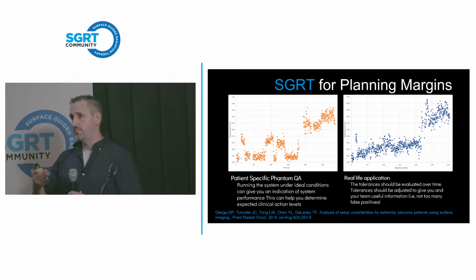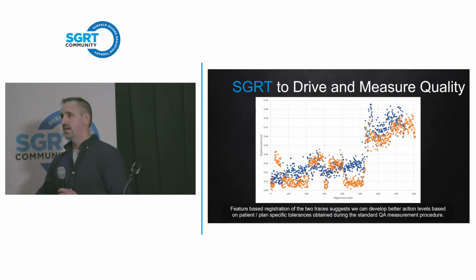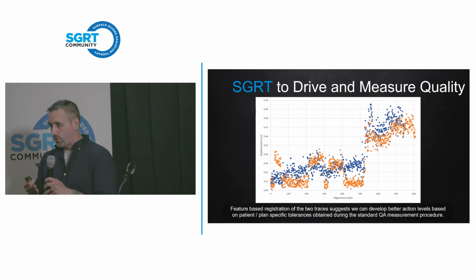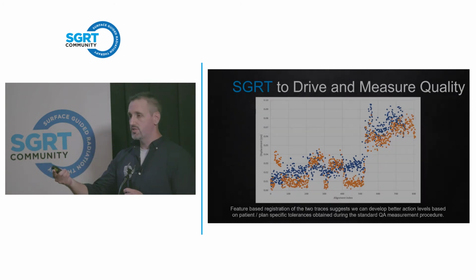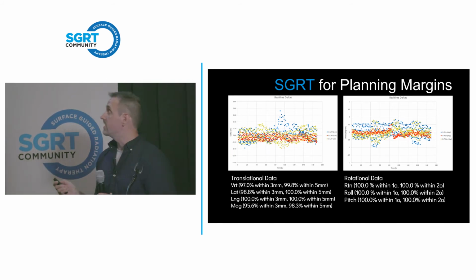So we can now set patient-specific margins. If you have a patient who has a motor cortex met, you can set them up in the device you fabricated them in, put them on the couch, run them through a set of 5 templated couch positions, and determine whether or not that mask is rigidly adhering to the protocol that you have set for them. Because if they have a motor cortex met and they have an involuntary motion, they may require additional PTV margin that you don't put on someone else. And so now we can look ahead and predict future states of patients before the patient is actually on the table, and we have to decide on the fly, did the plan account for this type of variability?